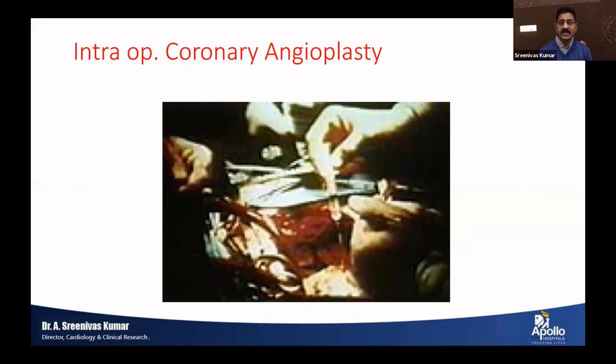So he requested his surgical colleague, anyway, on the table you are about to do the bypass, so before that I will put this balloon directly, inflate it, and see what happens to the coronary arteries. Surprisingly, nothing happened to the coronary arteries. In fact, the lesions were cracked. Later on, I think such arteries were grafted also. So that's how he became very comfortable, and he thought his idea would work.